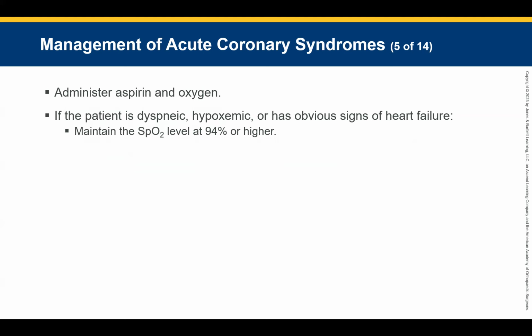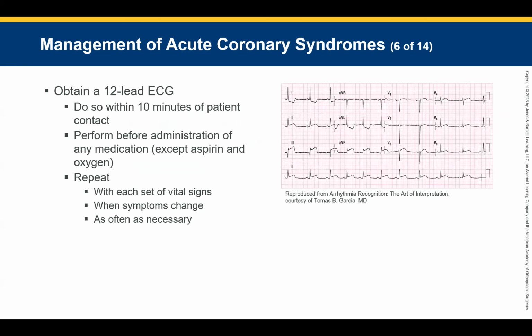Aspirin and oxygen. Okay, aspirin and oxygen. That's our first thing. 12 lead within 10 minutes of patient contact, preferably as soon as it's available. We've already run through that one. Should we run through it again for practice? Yeah, sure. Let's do it.